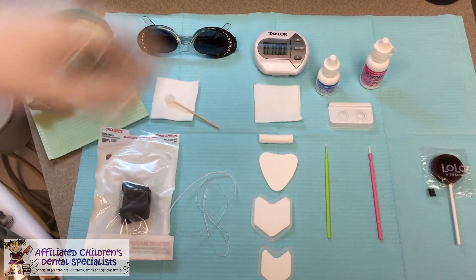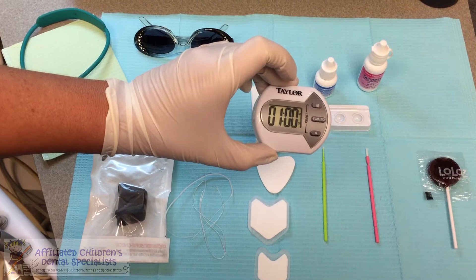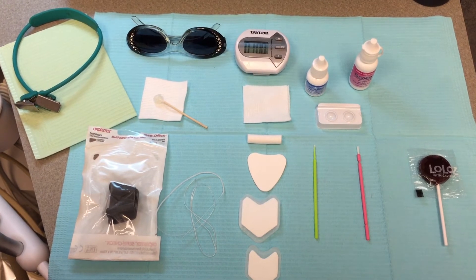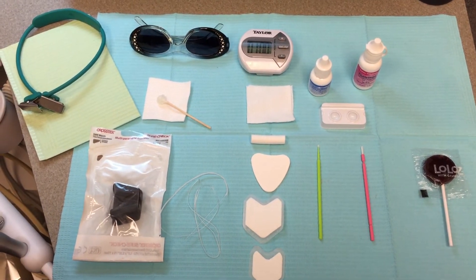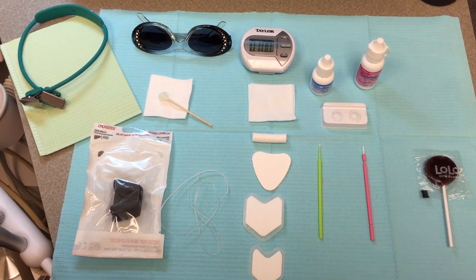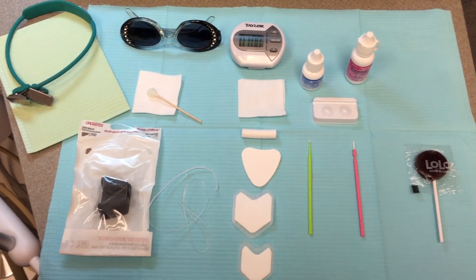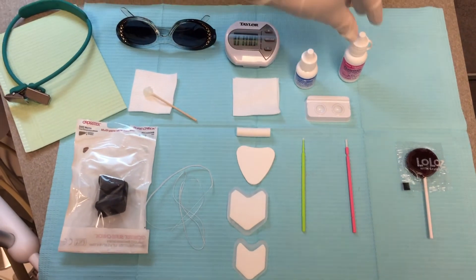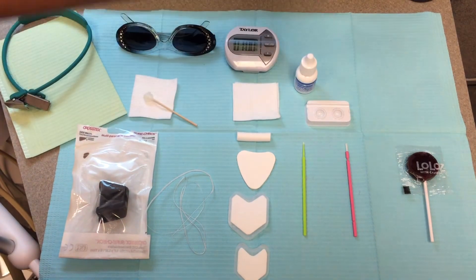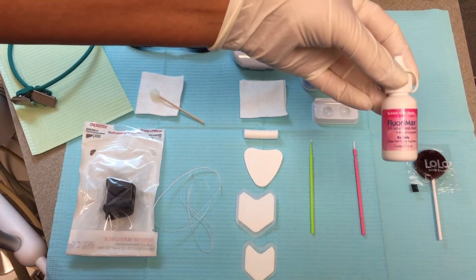Leave it on there for one minute. I like to have a little kitchen timer set because that can feel like a long time. Once it's done, I like to cover the area with varnish — one reason is to prevent saliva from washing in, giving more time for the silver diamine fluoride to absorb deeper into the enamel and dentin. Another benefit is taste, because the varnish tastes better. I like this 2.5% varnish from Elevate Oral Care; it comes in a bottle so you can put one drop next to your one drop of SDF, which reduces waste and cost.